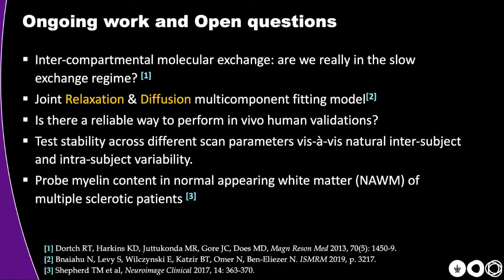Ongoing work, there's a lot of ongoing work, a lot of open questions. We need to take into account perhaps intercompartmental exchange. Most literature today claims that we are in a slow exchange regime, which means that during the course of one echo train, one echo modulation curve, there is not a lot of exchange. Reports state values of around 200 to 500 milliseconds as the mean residence time of protons on the myelin water pools, which is good, but this assumption needs to be revisited.